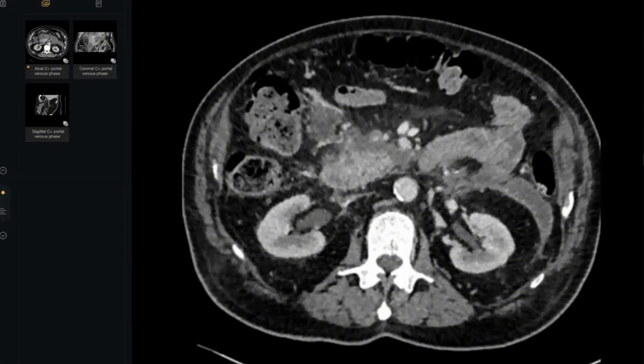I would like to check for the complications of this, including vascular involvement, searching for areas of aneurysms and leak, searching for involvement of the adjacent bowel loops, and other associations.